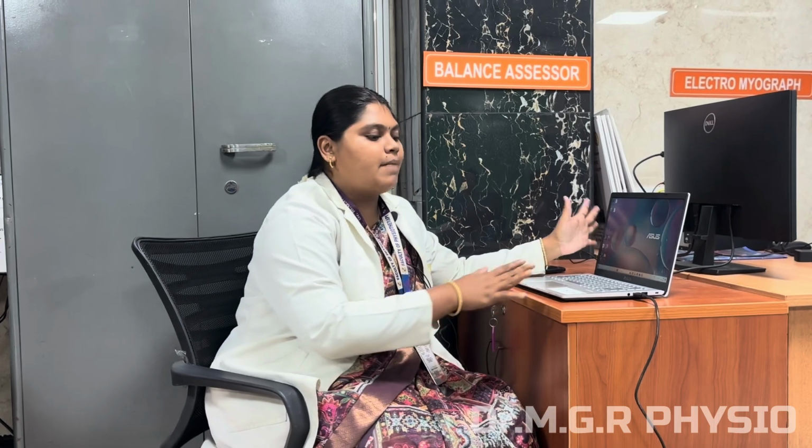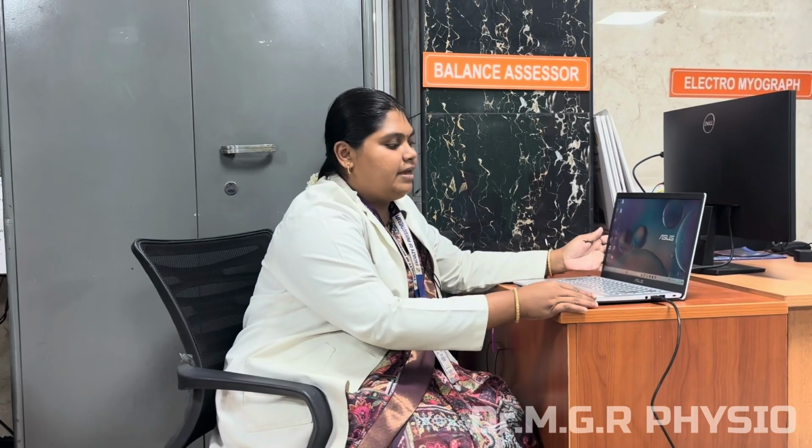Hi everyone, I am Dr. Pavitra Lochni. I have completed my Masters in MPT in Neurology. Currently I am working in the Department of Neurology, Faculty of Physiotherapy, Dr. M.G.R. Education and Research Institute. Today we are going to discuss the balance assessor. Actually its name is B-Track Assessor, which is used for balance assessing.